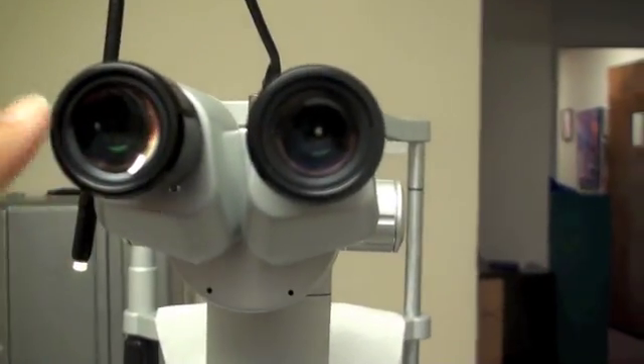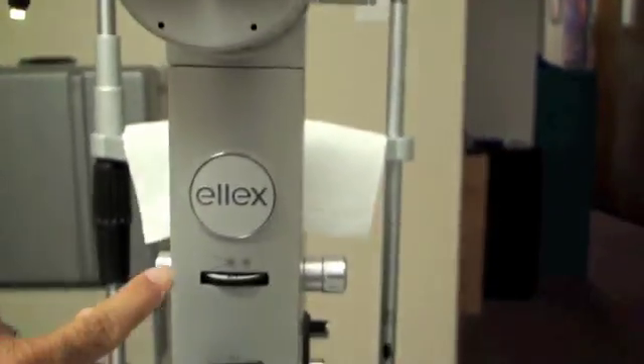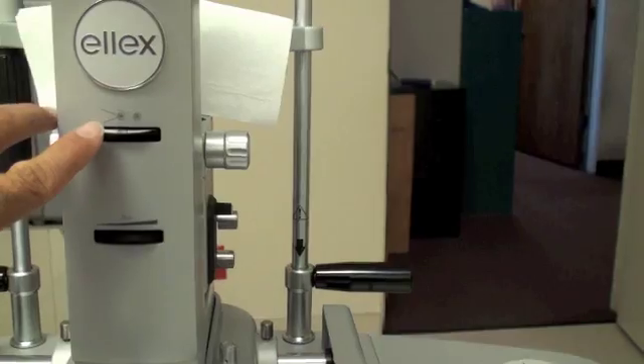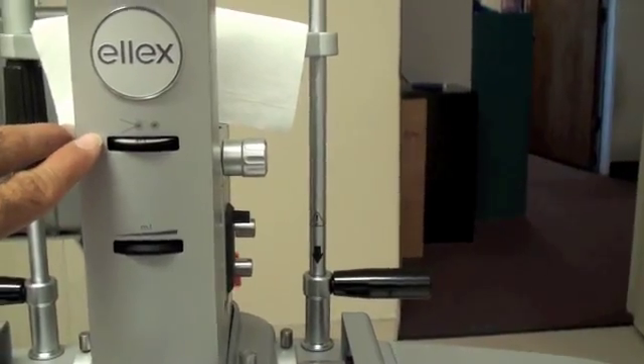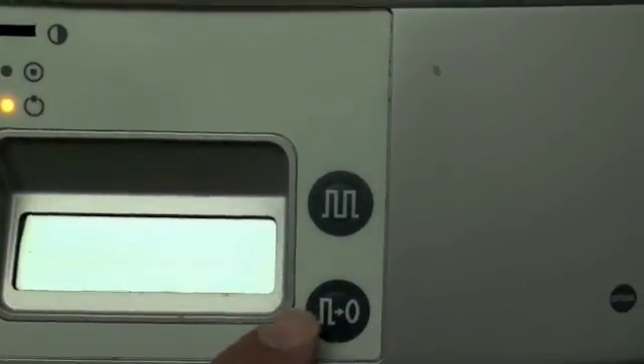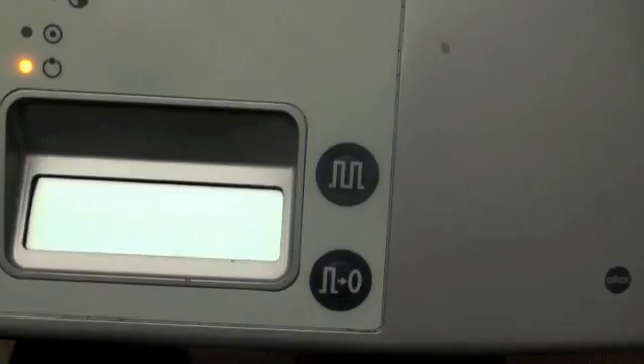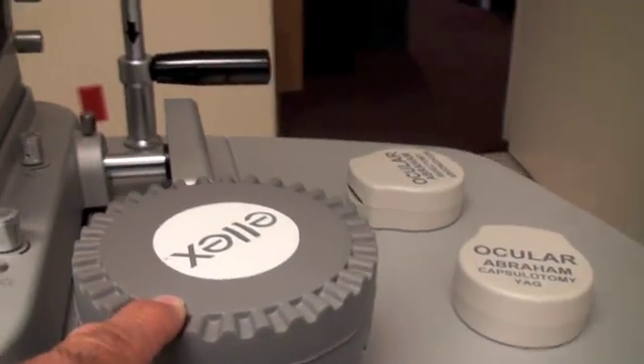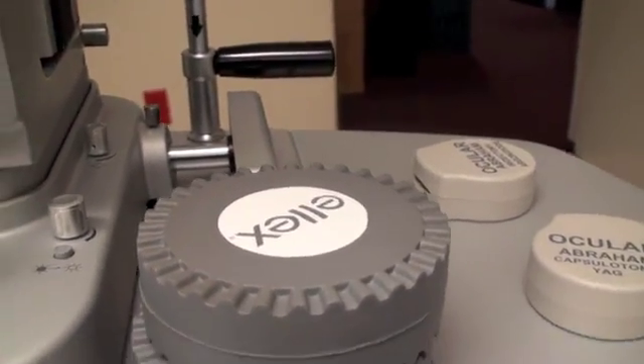The surgeon is looking through these eyepieces, and these are the controls for how much energy to use, where exactly the shot has to be focused. We get a readout of how many shots and we can control the number of shots. And you can see this hand rest for the surgeon, because we want everything to be stable.